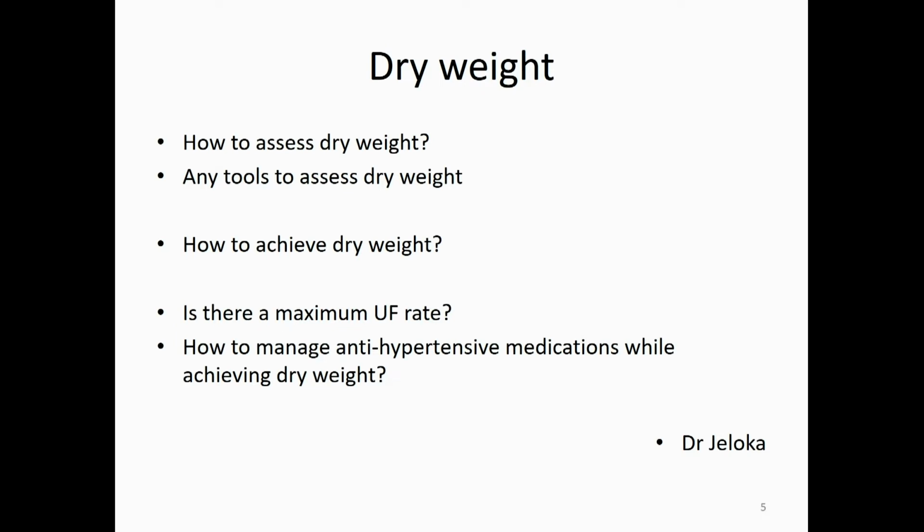Okay, so this is something practical. So when you see edema, that means definitely the patient is above his or her dry weight. So you start reducing the targeted dry weight. So somebody who has, for example, a weight of 50 kgs right now, and you see edema, possibly there are 3, 4, 5 kgs extra water in his or her body. So you will start decreasing or setting up the ultrafiltration accordingly. So you cannot put 5 liters of ultrafiltration at one go because patient may not tolerate it. So graduated planning should be there if a patient is new, and slowly you keep decreasing the dry weight.